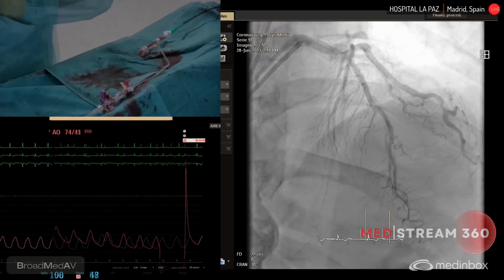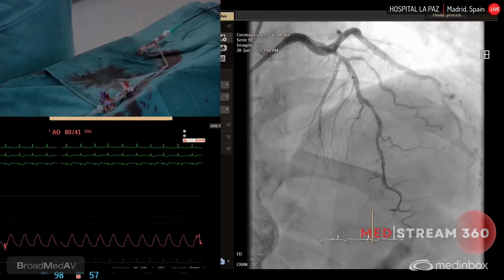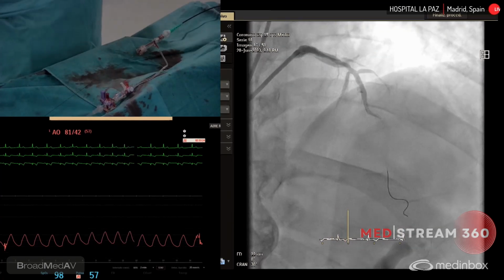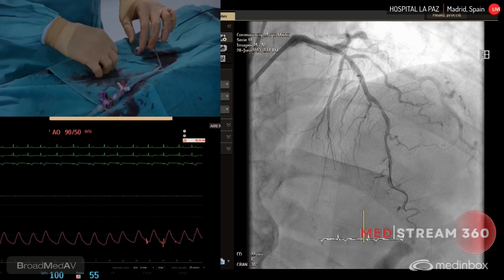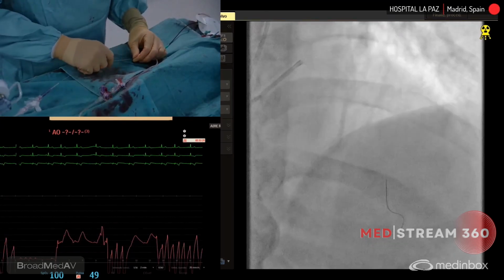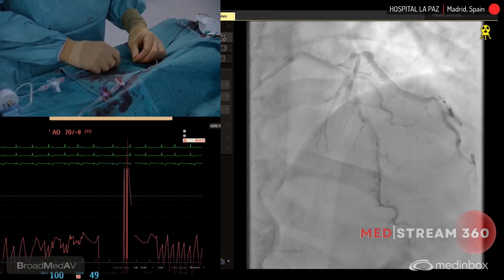Okay. Give me a stent 2.5, 18 or 20. The balloon was 15, right? So we're going to implant a Xience 2.5 by 18. The balloon was 15 in length. So I think that we are going to cover the focal severe lesion where we have seen the jump in the RFR measurement. So this trial and also the vulnerable trial that we are involved in are going to explain some interesting points in these non-culprit vulnerable plaques or not vulnerable plaques.